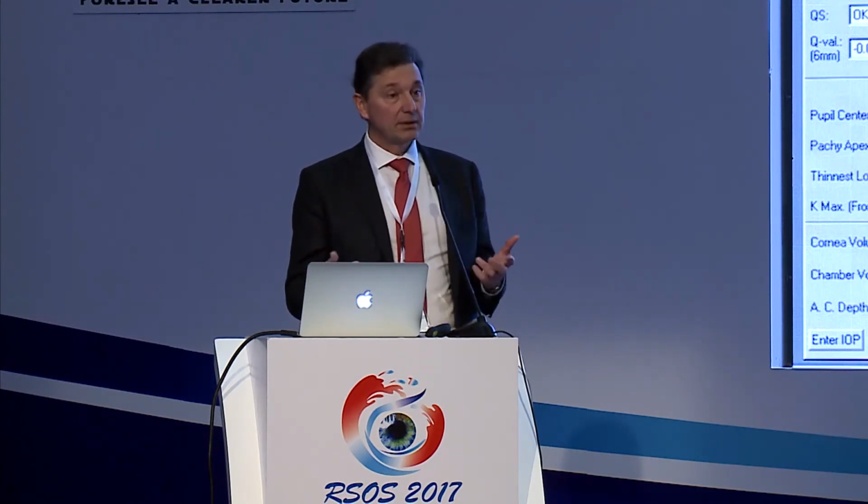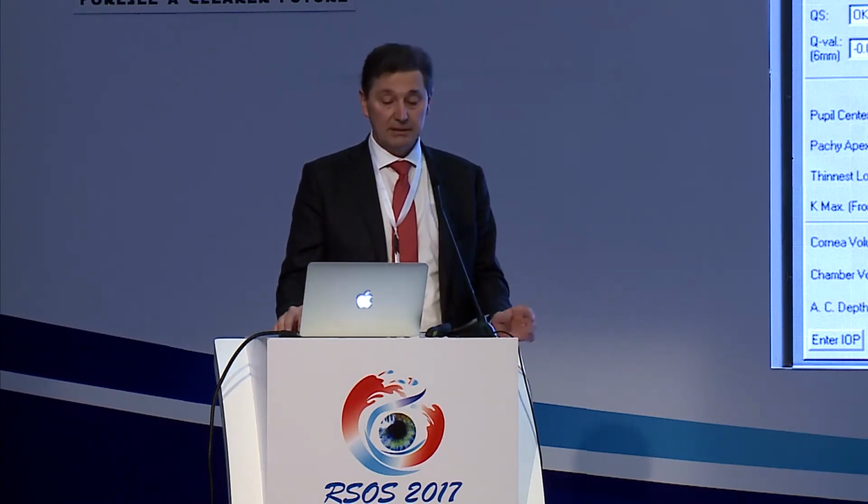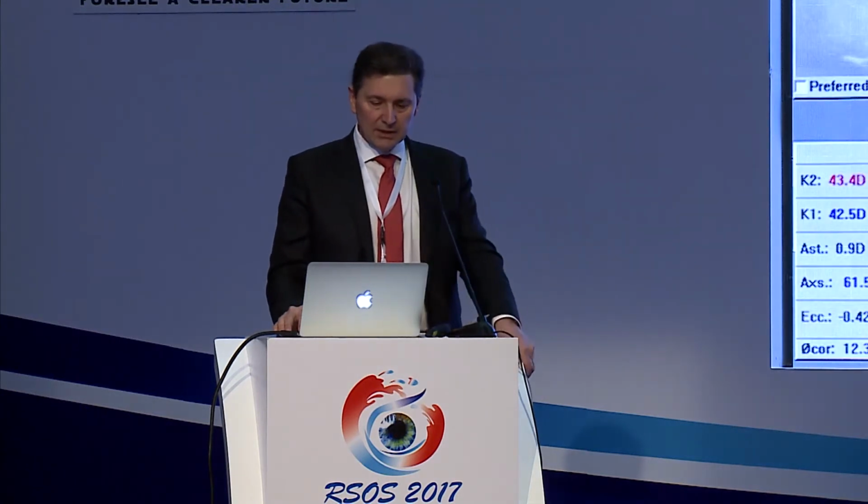What the surgeon had done was they got a decentered flap and decided for whatever reason to continue with the ablation. Did the ablation, then got really nervous during the procedure when they realized that a lot of the ablation was on the surface of the eye rather than under the flap, and put the flap back, and the flap didn't settle down well, and they just lost confidence and wanted to get rid of the patient. So they sent the patient on.